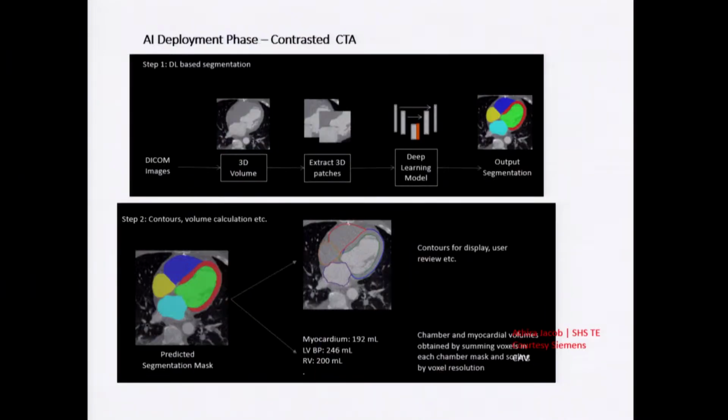But most of the software we use also combines AI to allow us to do the segmentation. This is a slide provided by GE, by Siemens. Kurt is one of the scientists. There's nothing particular about this algorithm. They validate, get output, get a prediction, and then compare.